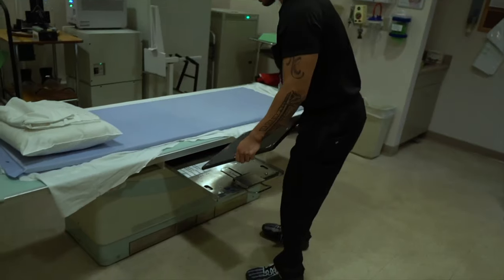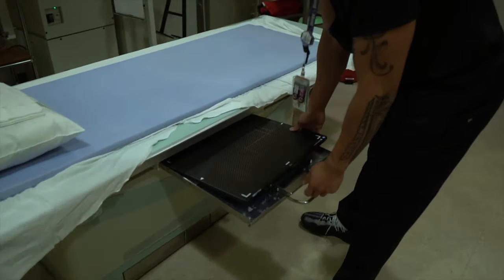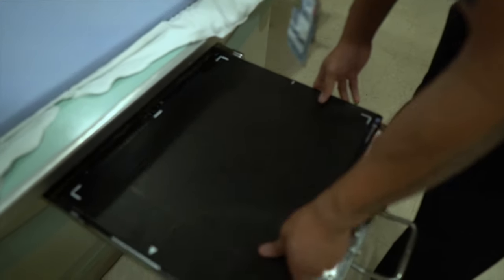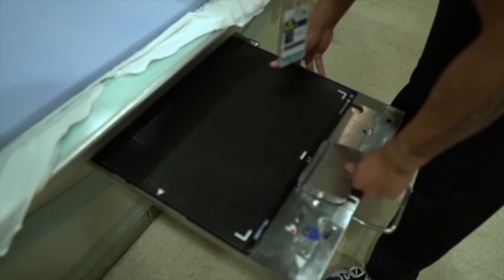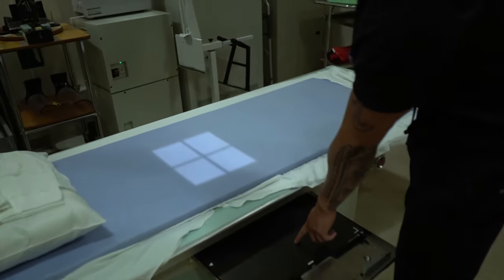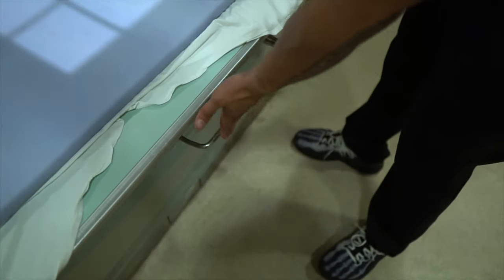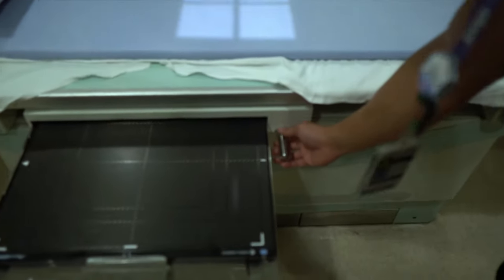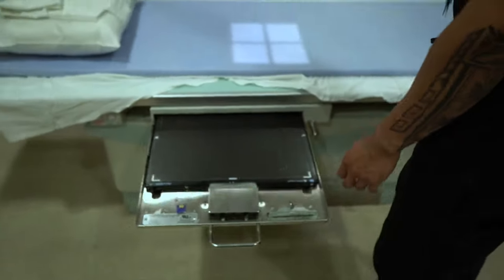To open the table bucky, there's a handle that you pull on — make sure it's fully extended out and the table is not covering the bucky in order to place the image receptor in. In this setup there's a latch that you pull up on and then slide away from the table to fully open the bucky. To secure the image receptor in place, slide the latch inward towards the image receptor and flip the latch down. To adjust your bucky position, there's either a button you press or a knob that you pull on or twist.